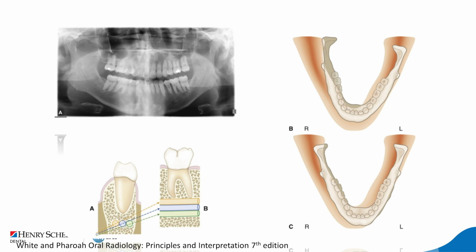Let's say you see on the image A on the lower aspect of the screen, if the mandibular canal is lingually positioned and you see it on the B, it will look a lot more inferiorly positioned than it is in reality. So you can assume in that case that you have, for example, 13 millimeters to place your implant, but in reality, you have 10 millimeters.